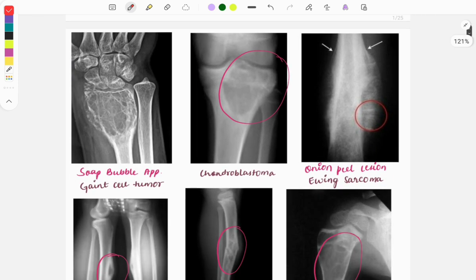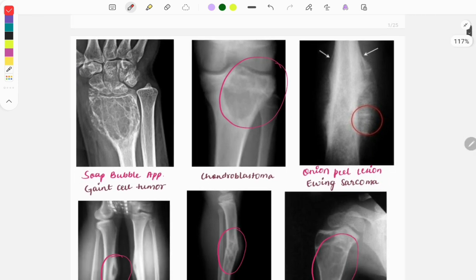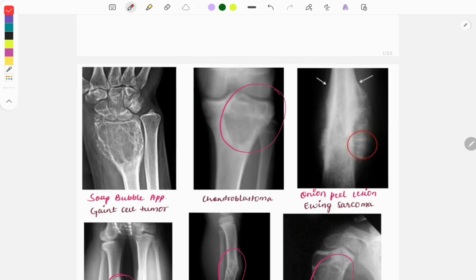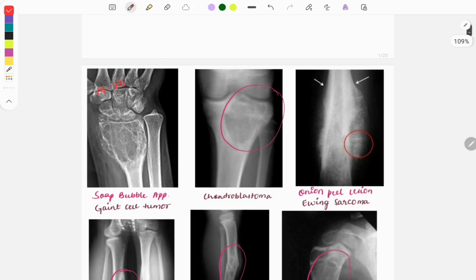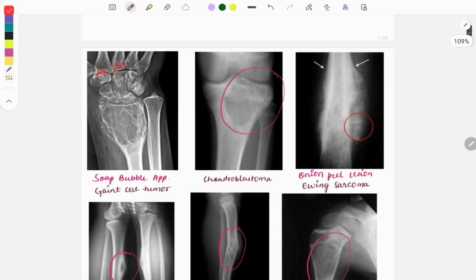Now let's discuss important images related to the skeletal system. This is an image of a giant cell tumor — you can see the soap bubble appearance. It is a tumor of the epiphysis, usually seen between the ages of 20 to 25 years.